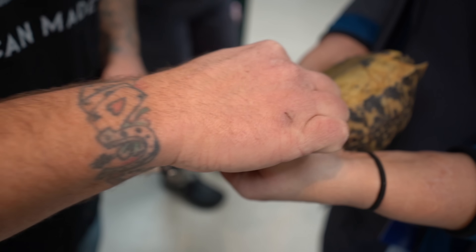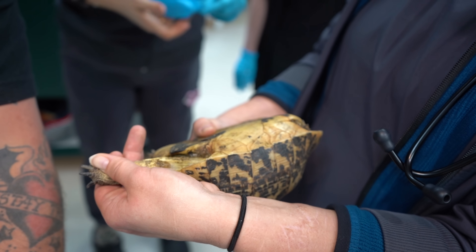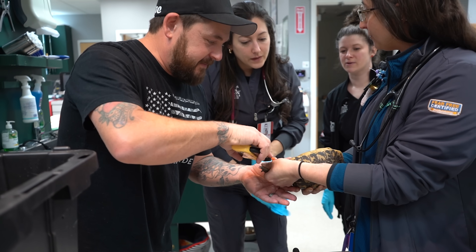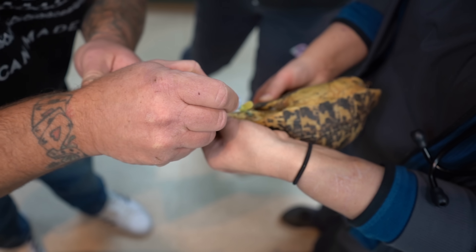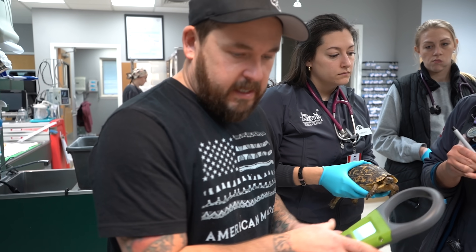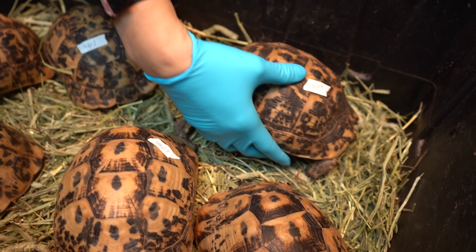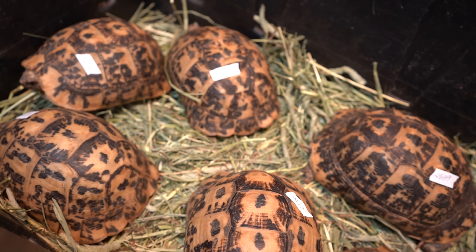Did you guys think you would be microchipping tortoises from Libya today? That's where these are from. Use the black handle, plunge it in there. The last four are four, six, six, nine. Okay, group two. Now onto the second group.